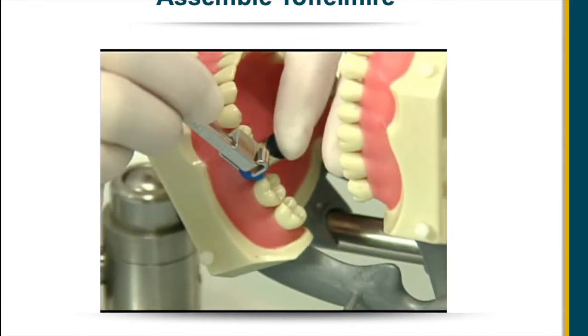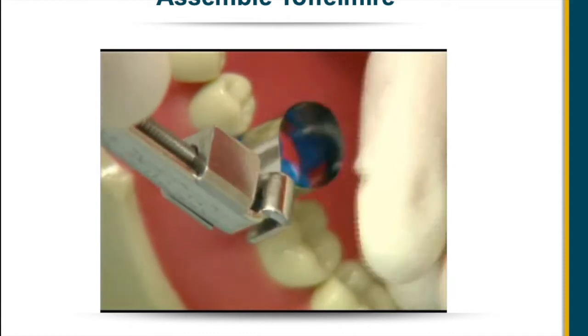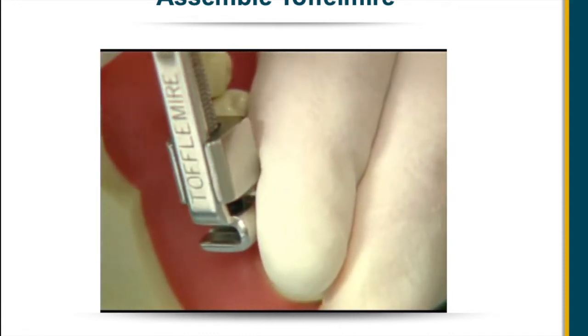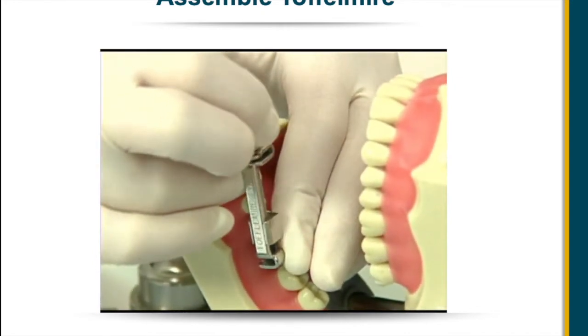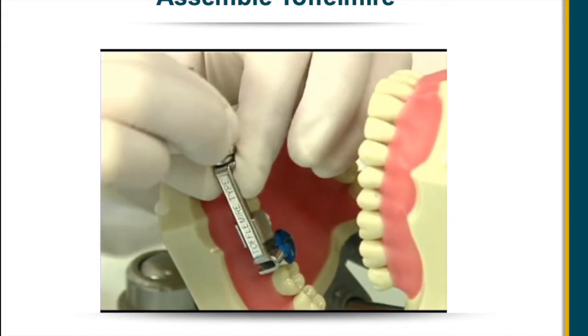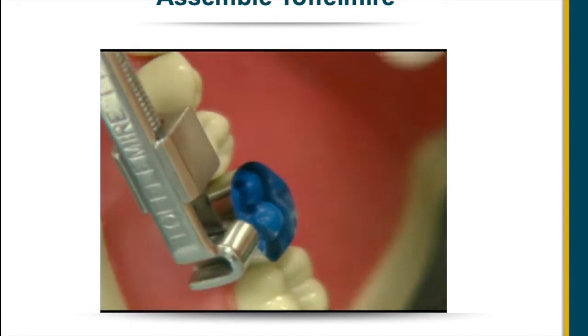of the tooth, making sure the band remains beyond the occlusal edge approximately 1 to 1.5 millimeters. The band is held securely in place by finger pressure over the occlusal surface of the band. Turn the inner knob clockwise slowly to tighten the band around the tooth. Use the explorer to examine the adaptation of the band. At this point, the proper wedge will be selected.